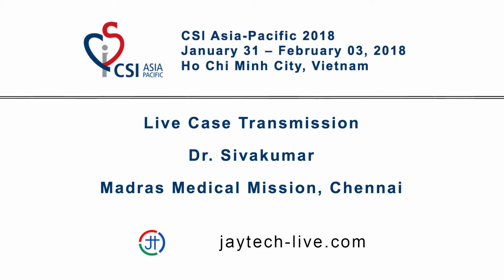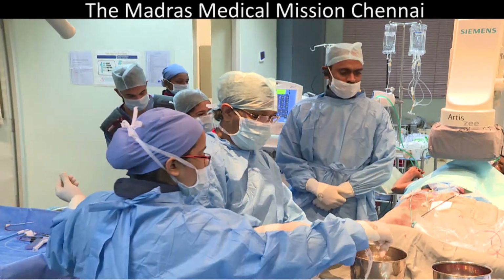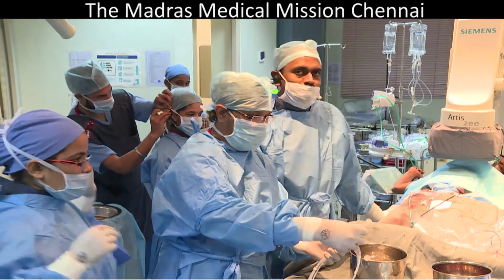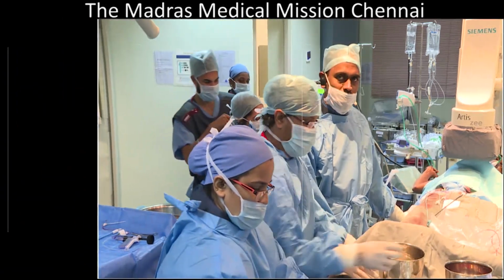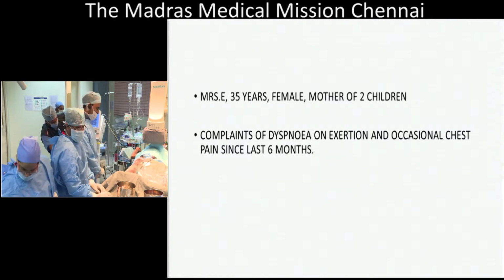I have Dr. Srija, one of my senior colleagues here, who started this patient and got the initial hemodynamics. This is a lady of around 35 years, identified to have a large atrial septal defect and severe pulmonary hypertension. You'll see the PowerPoint.